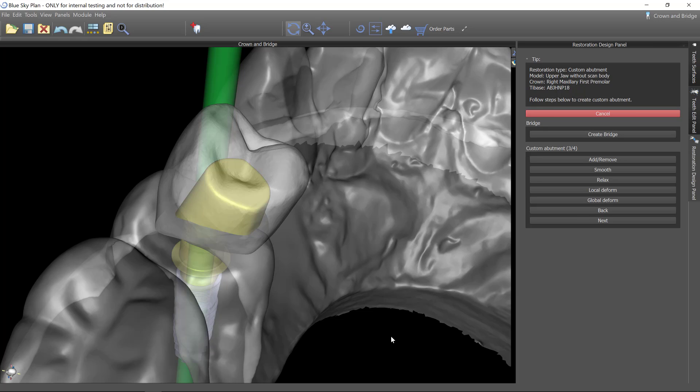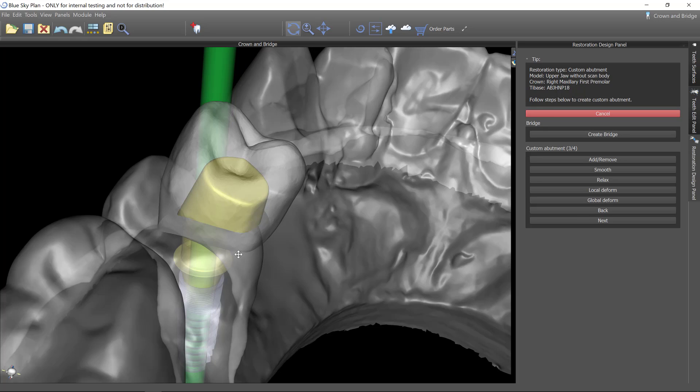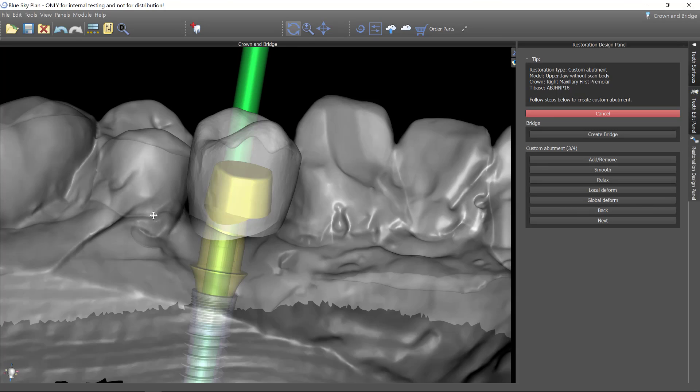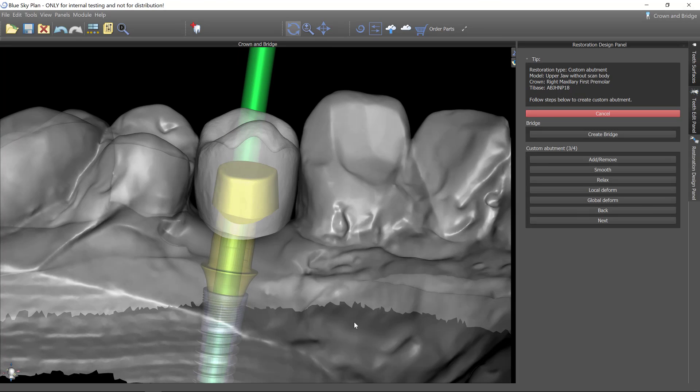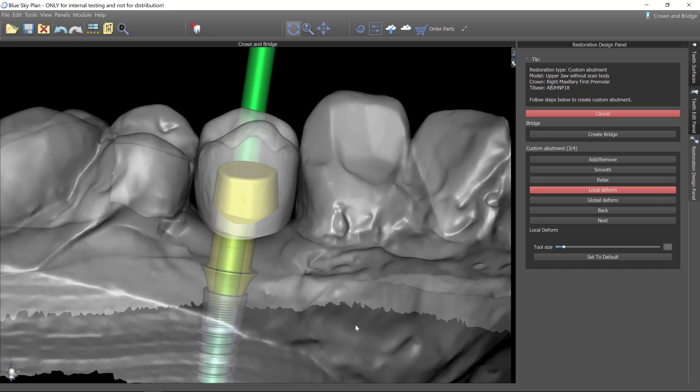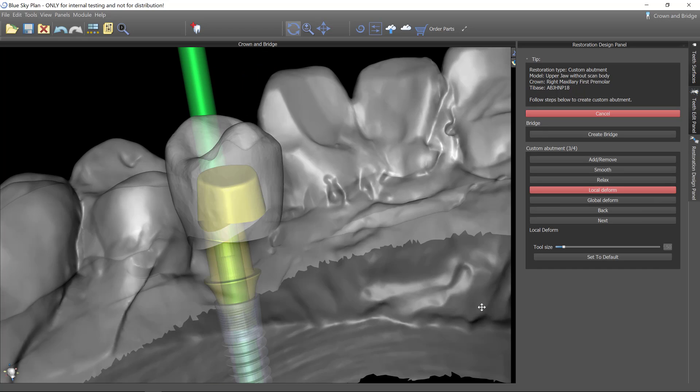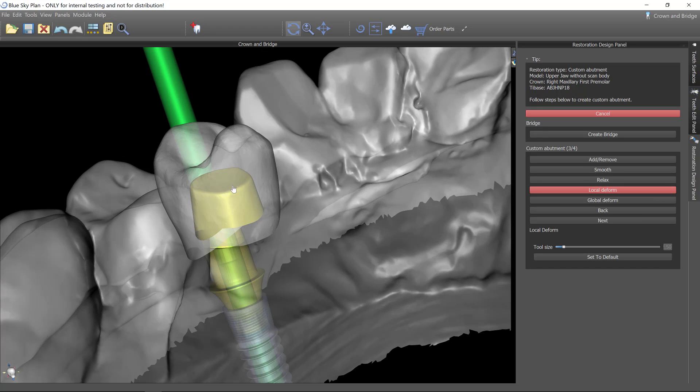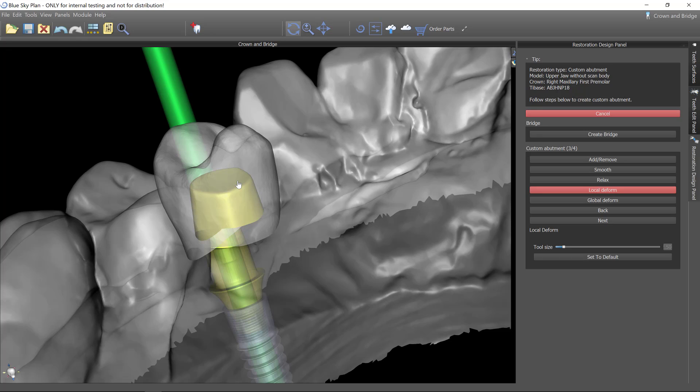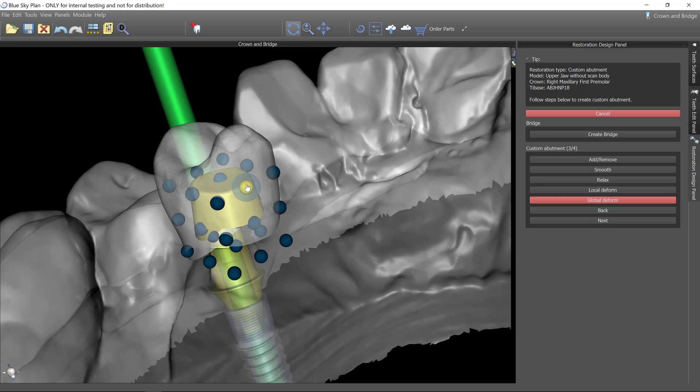And at this point I can add and remove. I've got all the same tools that I had earlier. So I may actually do the local deform tool here and drag up a little bit, actually the global deform tool and drag up a little bit of a cusp tip.